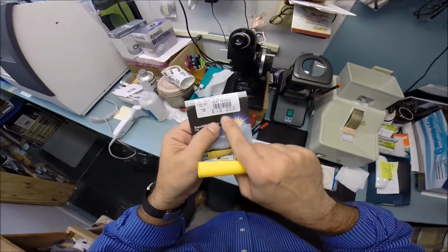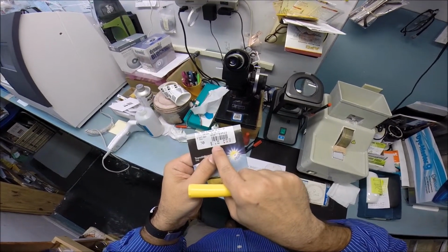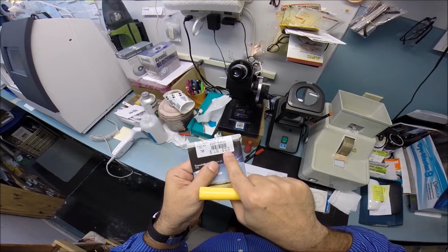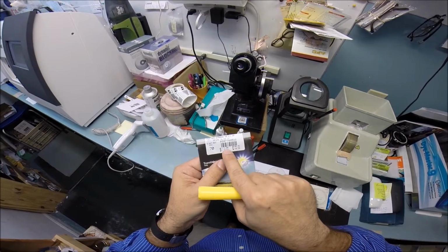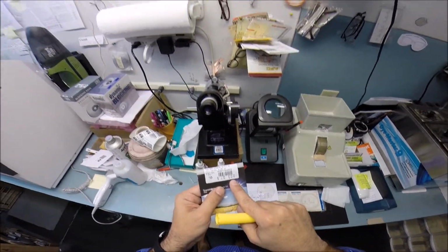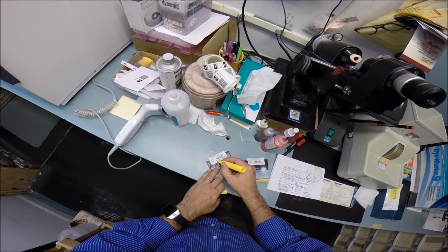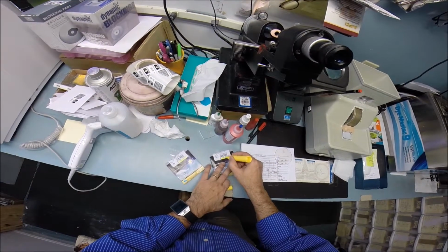And by the way, one thing I would like to mention, there are 2 ways you can write prescriptions. You see 2 different prescriptions, -1 1/4 +75, -50 -75. A long time ago, doctors would write prescriptions in plus cylinder. Now everything is in minus. So I'm just going to highlight this because you will receive the original lens packets.